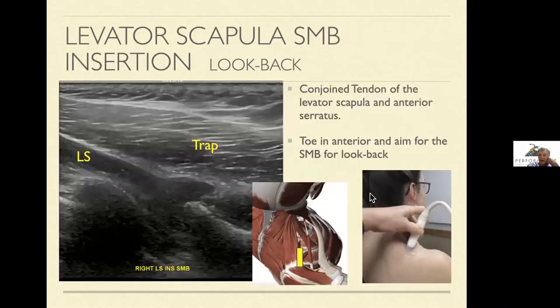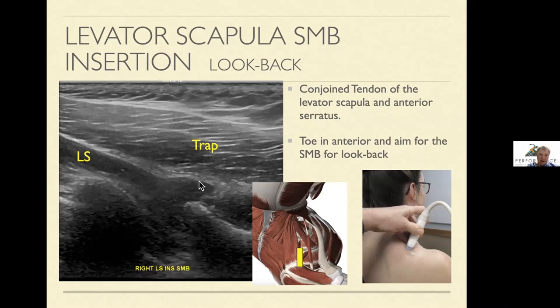Then I'll go back to my original position, slide up and down the neck, and get centered over the superior medial border of the scapula. I'll toe my probe down anteriorly to look back into the superior medial border — if you do it correctly, you'll get a sharp margin for the underneath surface. This is the second rib, this is trap, and this is levator scap. What's important to realize is that this area is a conjoined tendon of serratus anterior, levator scap, and rhomboid major. Because it's a conjoined tendon, you have to evaluate all three aspects.